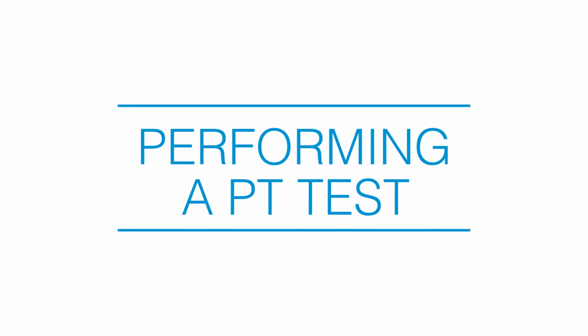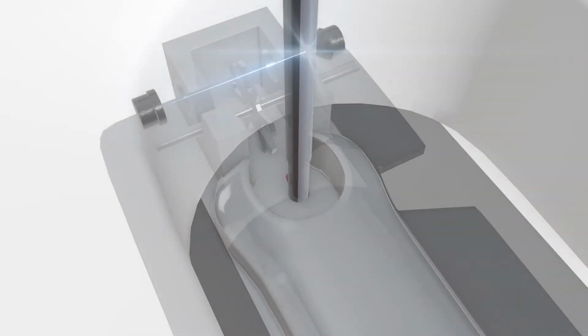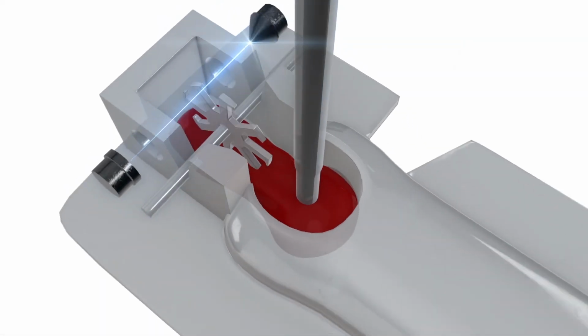Performing a PT test. This video provides a brief overview of how to perform a PT/INR test.